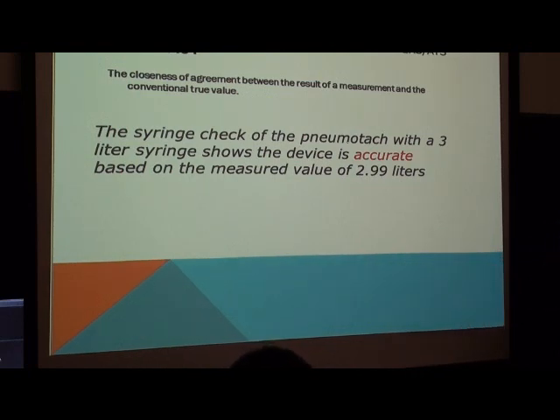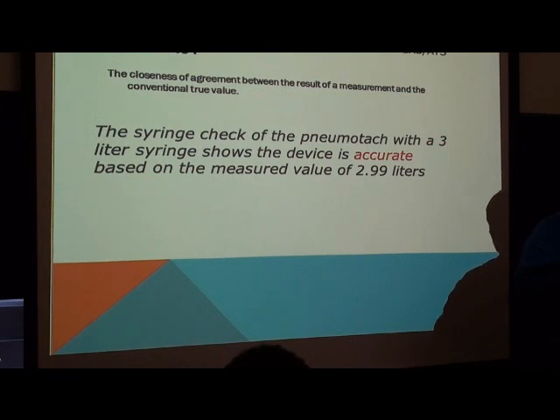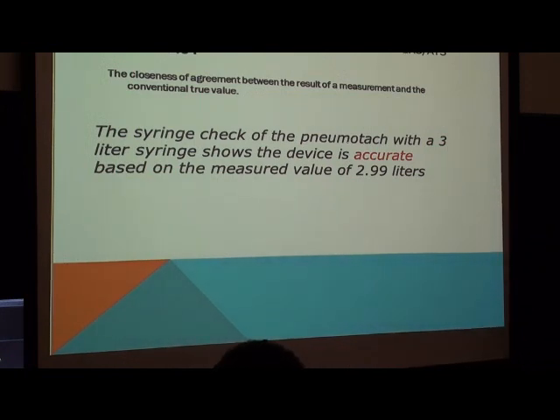And also for other tests, body plethysmography is most notable. So not only do we want to be sure that we're measuring accurately, but we want to make sure that we're measuring accurately over a variety of clinically encountered flows, and that expiration matches inspiration. Those of you that do lung volumes know what happens when they don't.